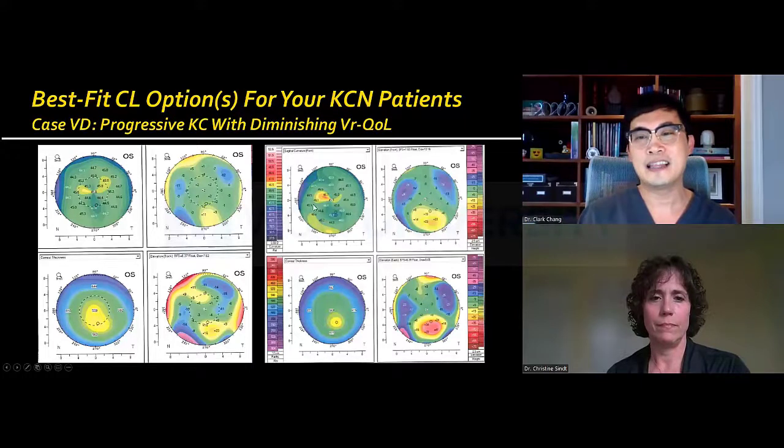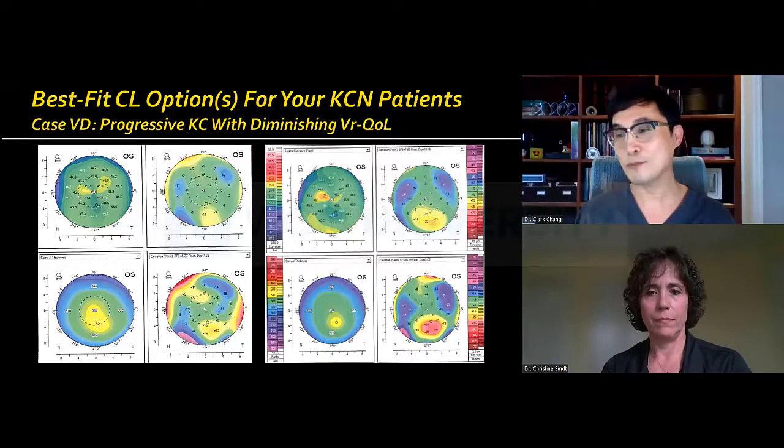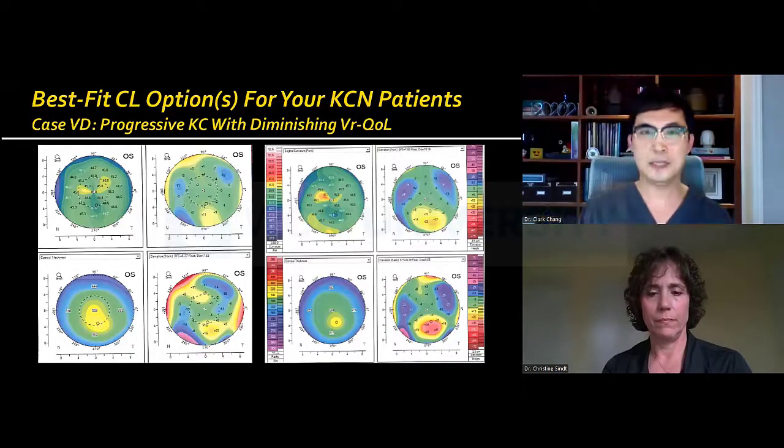And 6 months later, even though there's still no inferior steepening, you could definitely see the posterior elevation and anterior elevation all increased. And you're starting to get that sort of crab claw, pseudo-pellucid type of pattern, even though there's still no inferior steepening. So you really can't just say IS ratio asymmetry, like we talked about in the last lecture. I did wish that I would have been able to help this patient a little bit earlier rather than putting him through contact lens fitting for another 6-7 months in between these two exams.